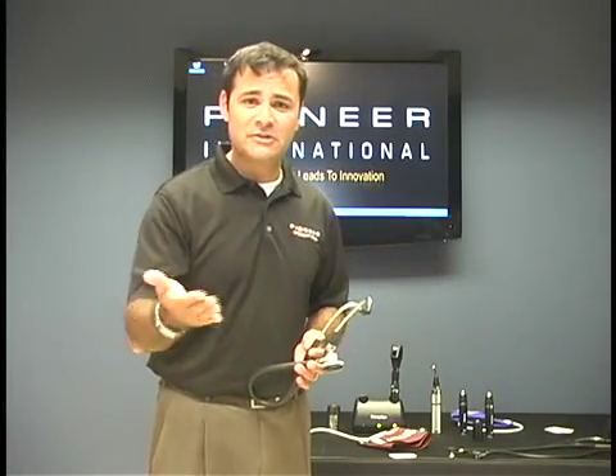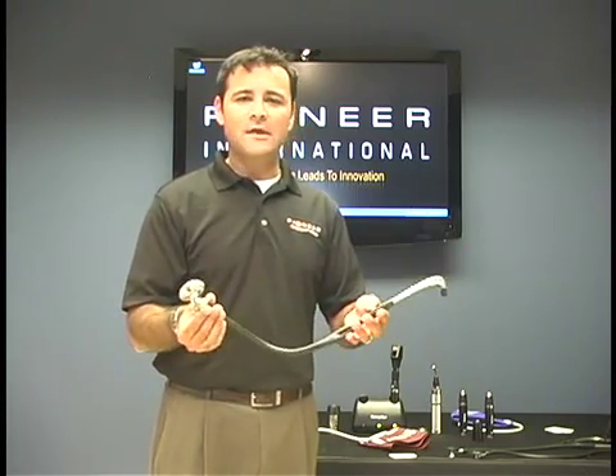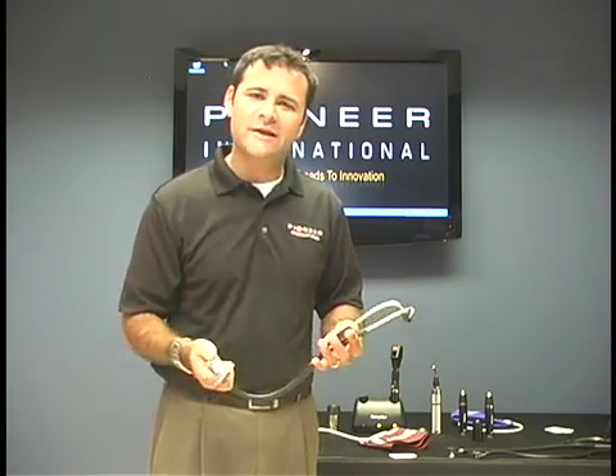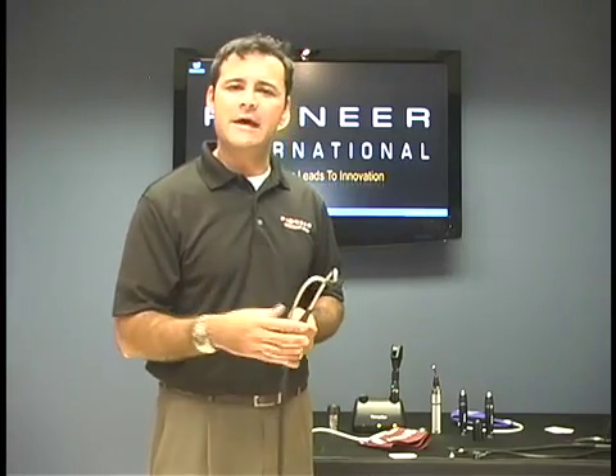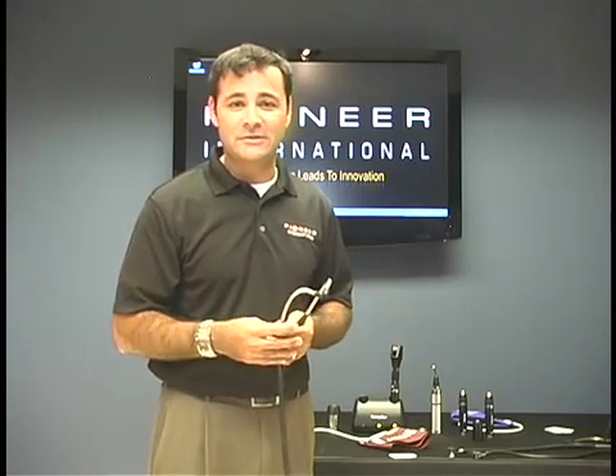There are many different stethoscopes out there, and if you happen to be hearing impaired, there are even electric stethoscopes. Let's talk about the cardiology grade stethoscopes. These are going to be like your FM stereo — you can really pick up the sound. If you're one of those iPod users, you might want to look at these pretty seriously.